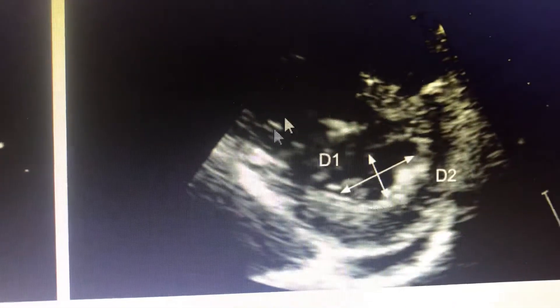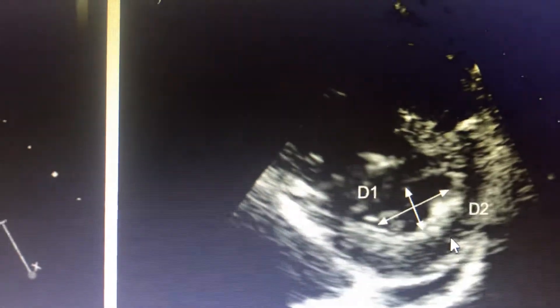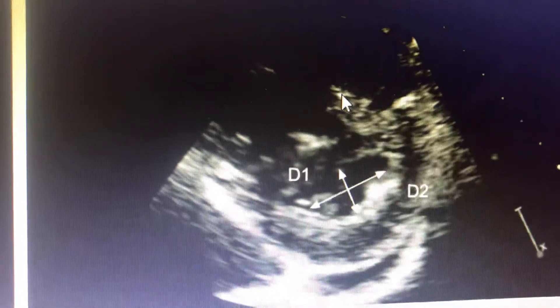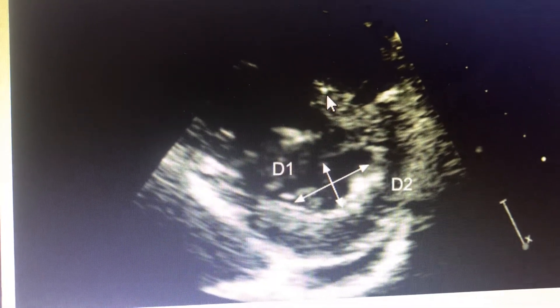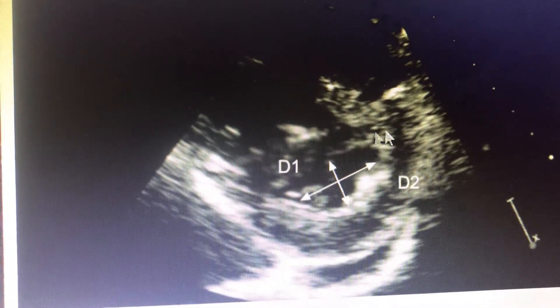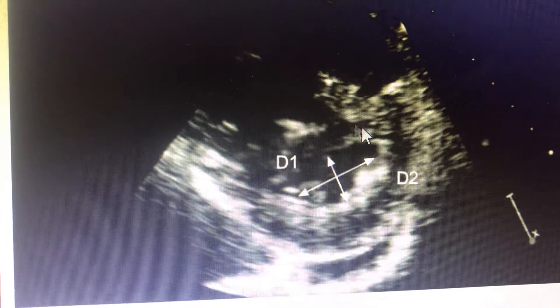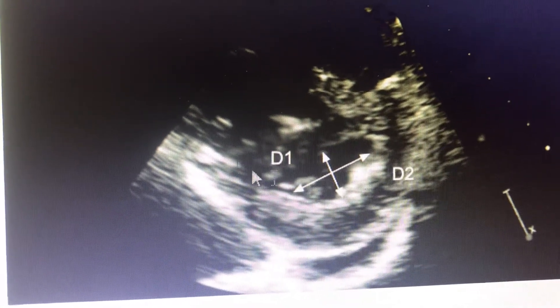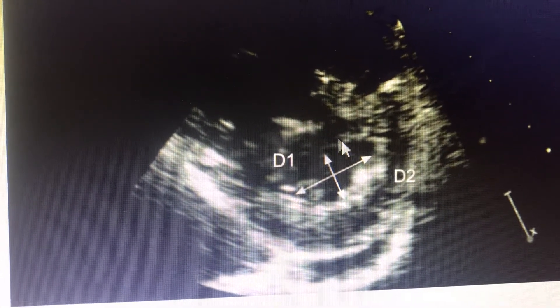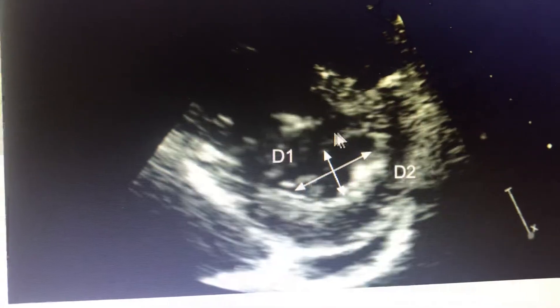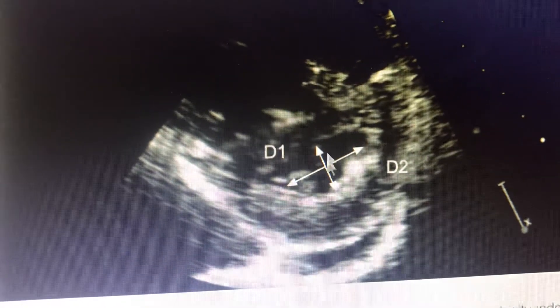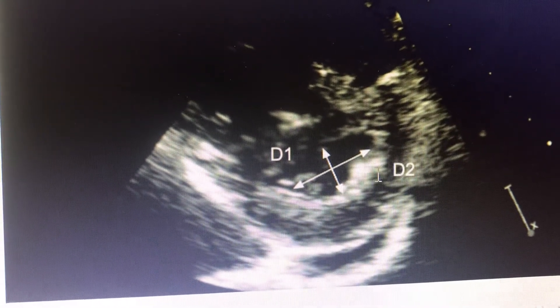This is the diastole and this is the systole. In RV pressure overload — such as acute pulmonary embolism and Scimitar syndrome — where there is pressure overload, systolic flattening of the septum occurs rather than diastolic flattening. The end-systolic LV Eccentricity Index will be more than 1 in RV pressure overload situations, because the septum gets deviated towards the LV in end systole. D2 remains the same but D1 goes on reducing, so D2/D1 becomes more.